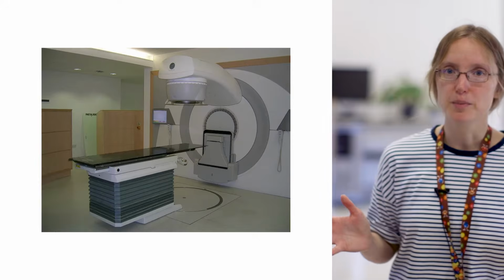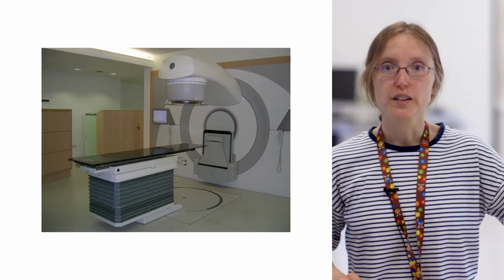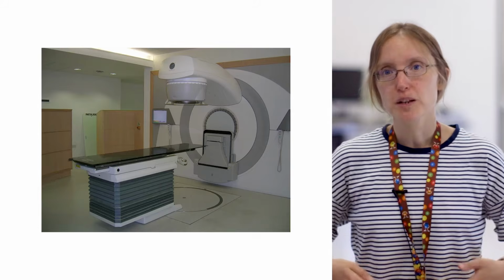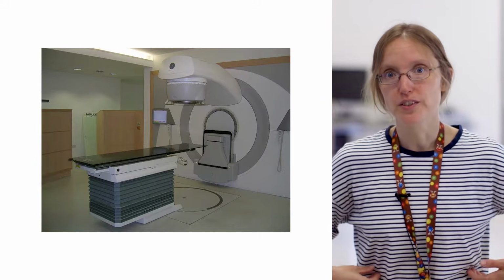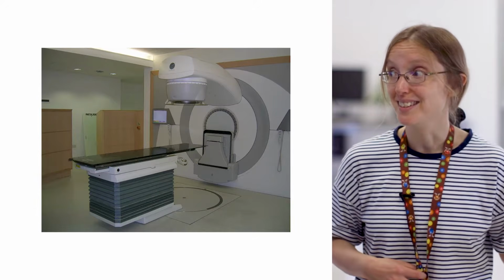And here's the machine that does the business. This is our radiotherapy linear accelerator. You can see it's got a black couch, the same as the one on the planning CT, and again it's got those marks on the side, so we can line the patient up in reference to the tattoos that they've got using the laser lights, so that we get the same position on the outside as we had when we did the planning CT scan.